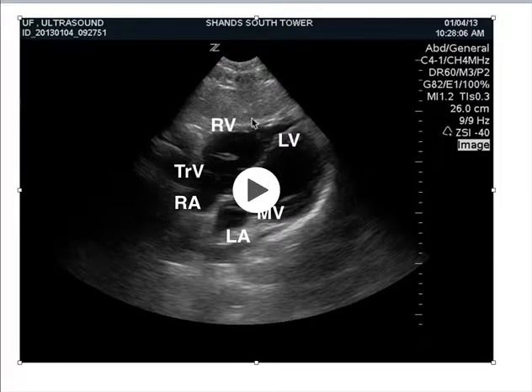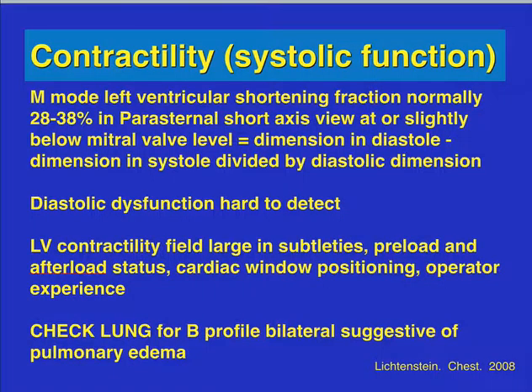Even though this is not clear, sometimes in COPD patients, when you put your probe in the subcostal region, it actually looks like an apical view. So that's why it's important to know all the different views and conditions where you see the differences.